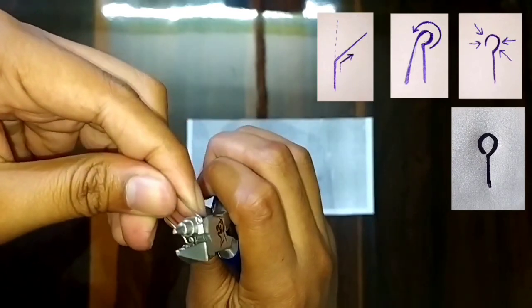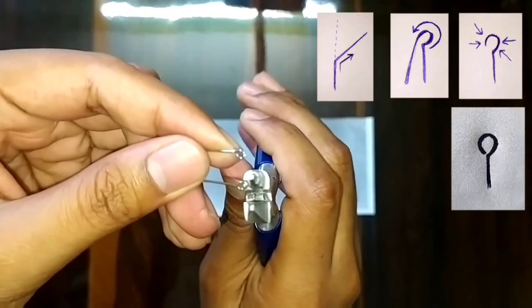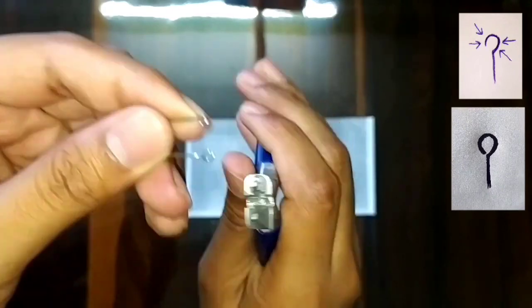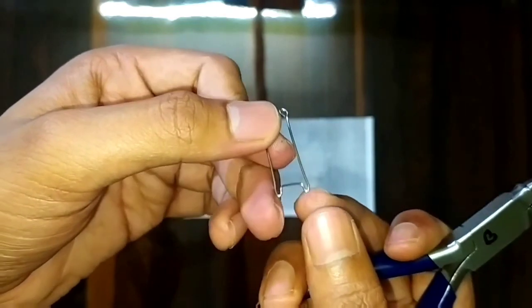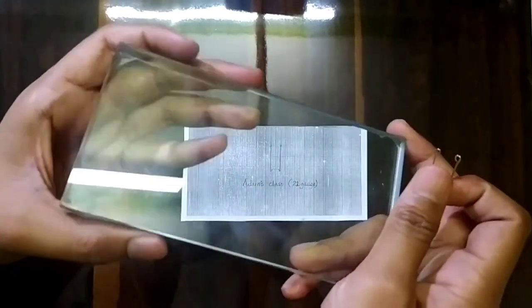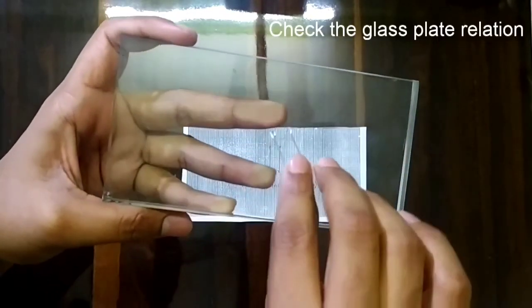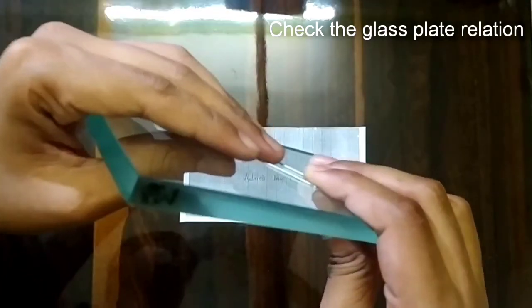In this way, our clasp is almost ready. We will check it whether it is in the same plane or not on the glass plate. We can see here that the retentive arm is little bit uplifted here and similarly on the other side too, it is not touching the glass plate.